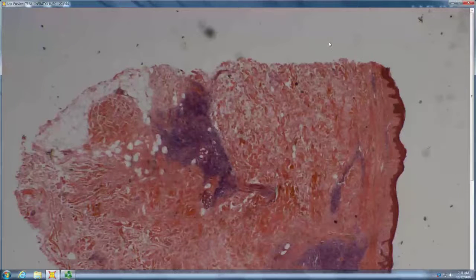The history in this case was lupus. Very commonly overlying lupus panniculitis, you have morphea-like sclerosis. In other types of lupus, you'll occasionally see morphea-like sclerosis, and some patients truly have overlap of the connective tissue diseases, which is why we often phrase it as connective tissue disease rather than specifying one particular.